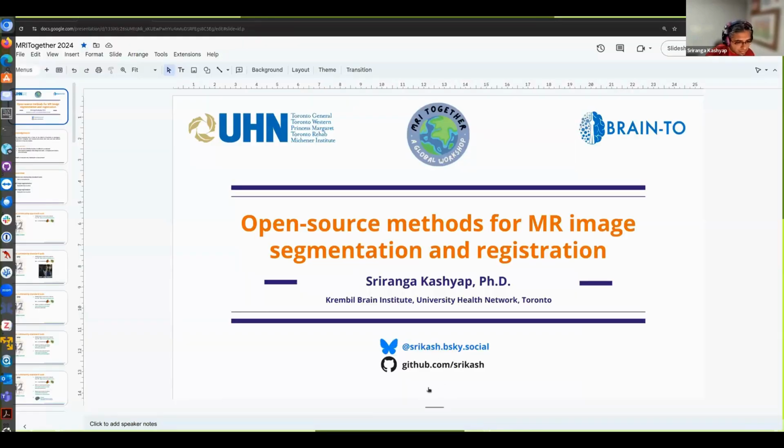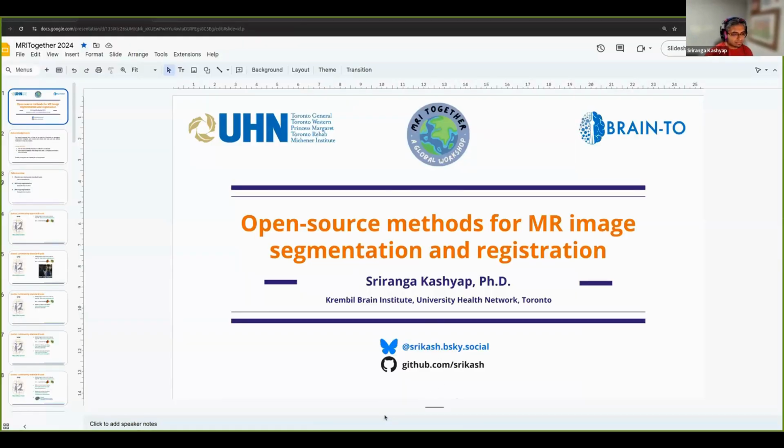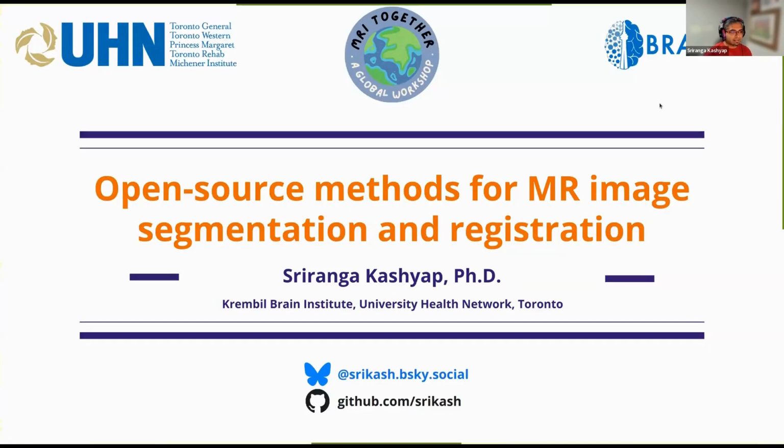Okay, I'm unmuted, I think. Going to share my screen. Thank you for the kind introduction. And just starting my timer. Hi, everyone. Thank you for attending this brief tutorial on open source methods for image segmentation and registration. My name is Sriranga Kashyap. You can call me Sri.